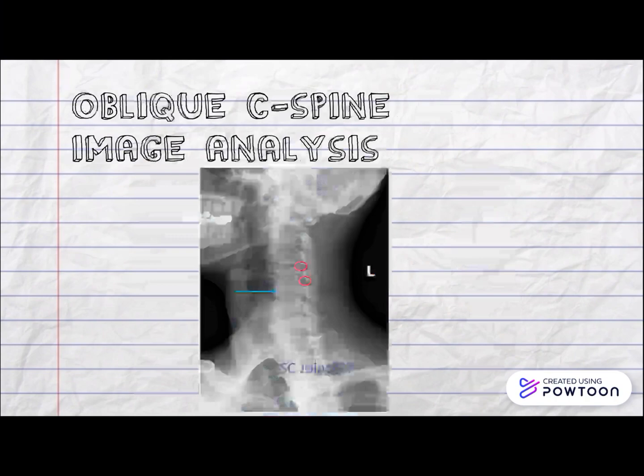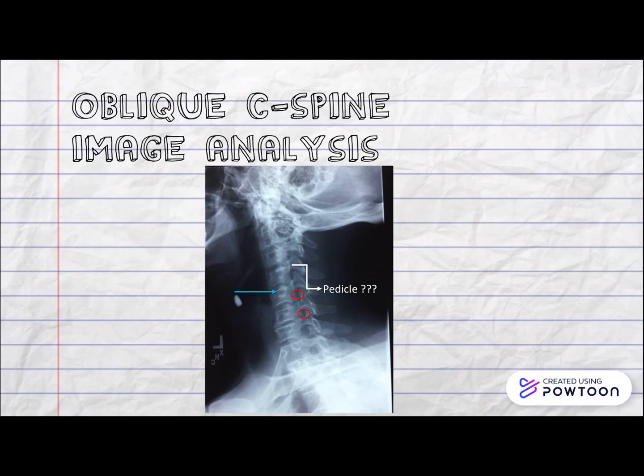So for this image, I would rotate the patient back a little bit and probably tilt the chin a little more to get a quality image.